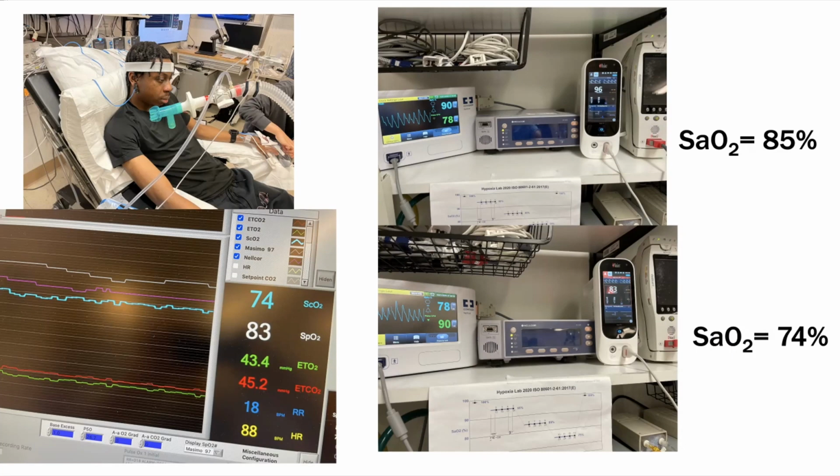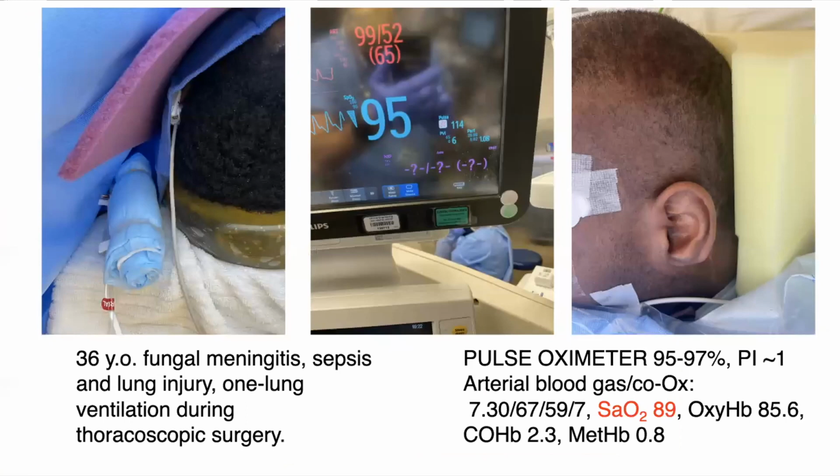But when the pulse oximeter was reading 90 and 96, his blood oxygen saturation was 85. And when the blood oxygen level was 74, it's also depicted on the computer screen on the lower left, the pulse oximeters were reading 78 and 83. So we see this not infrequently under these conditions.